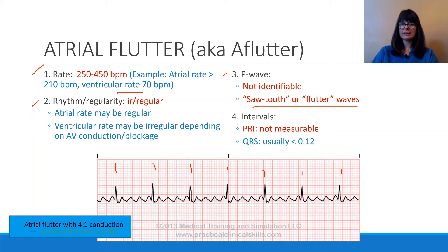The QRS in atrial flutter is usually normal, which is less than 0.12 seconds. Looking at the QRS complex here — starting at a thicker box — that would be one, two: in our case, 0.10 or 0.08, which makes the QRS complex normal.